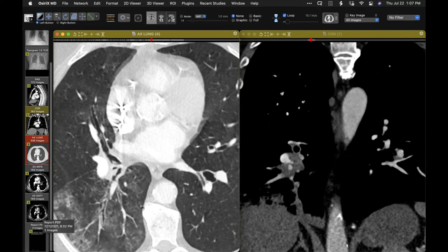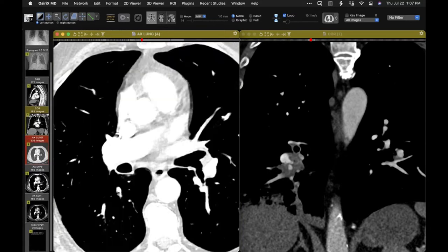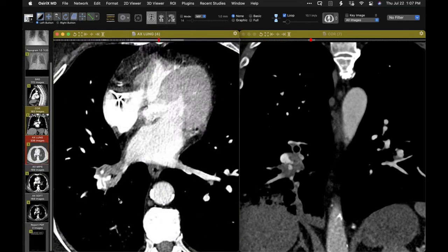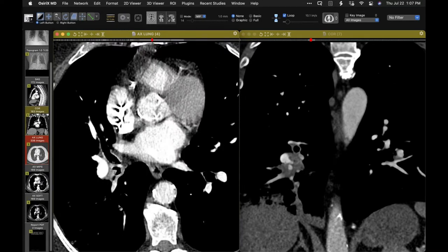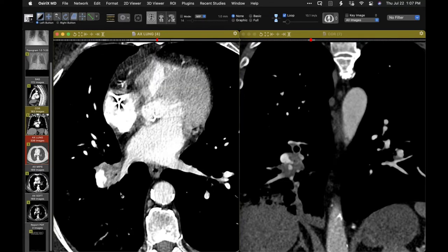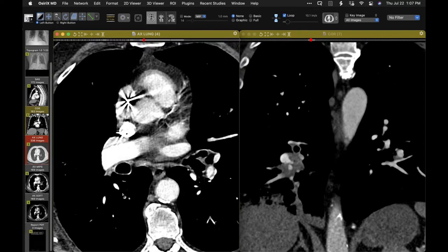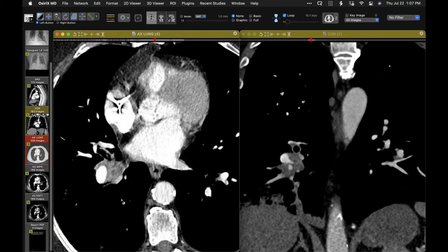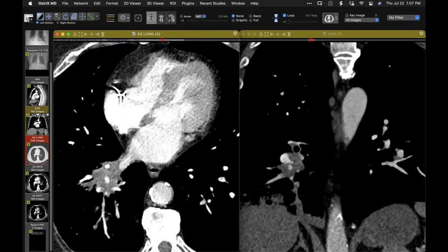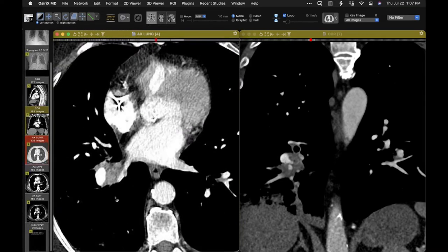So what is exactly going on there? I wondered whether there could be a pre-existent lesion, maybe even including a non-metallic foreign body of some kind that may have started in there and produced that abnormality and then became complicated by something else. But I don't know that. But I certainly wondered about that at the time, whether there was a substantial intraluminal component that subsequently evolved to produce these other findings.